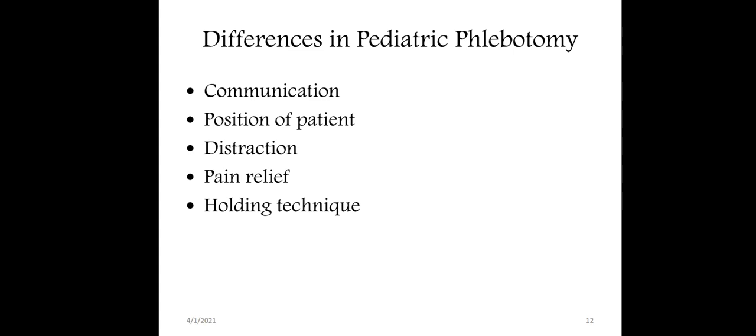For that, there are differences in pediatric phlebotomy from adult phlebotomy. So what is the difference? Number one, communication, position of patient, distraction, pain relief, and holding technique.